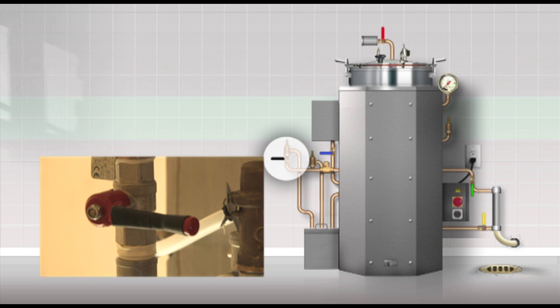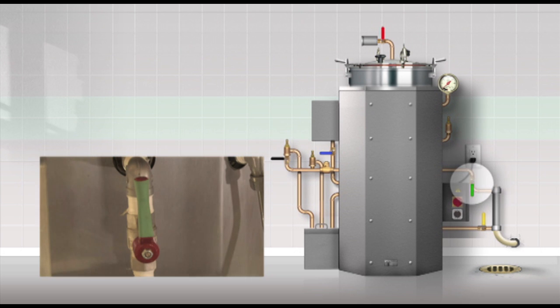In this demonstration we will sterilise at two bar. So the valve is to be closed. Green is the air removal steam release valve. It should be open.